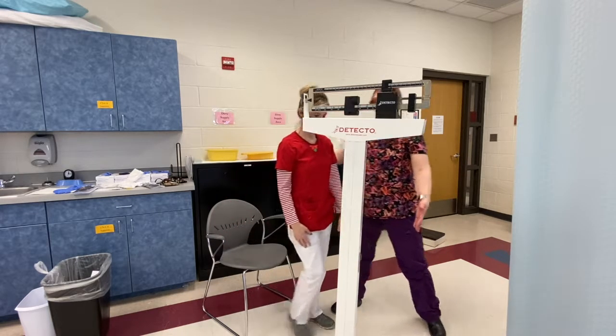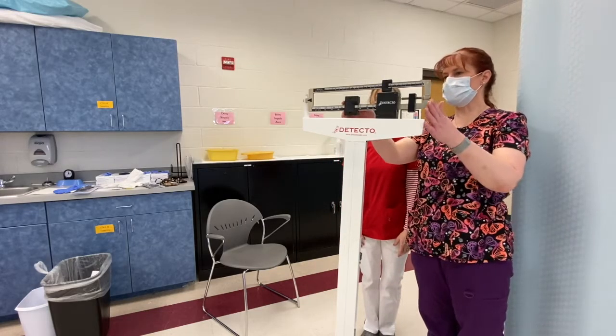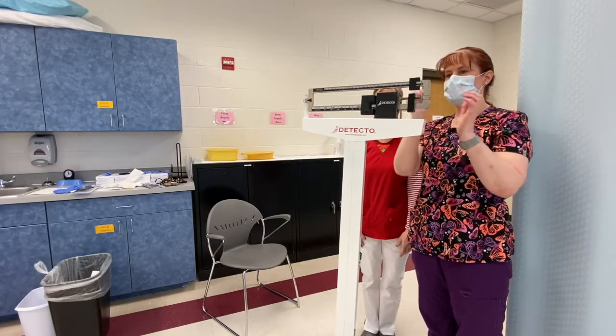I'm going to have you step on the scale. If you'll step up carefully — hang on just one second — let me zero out my scale.